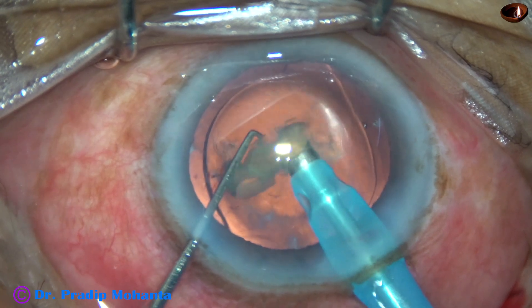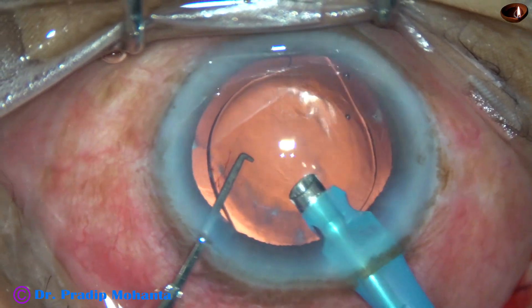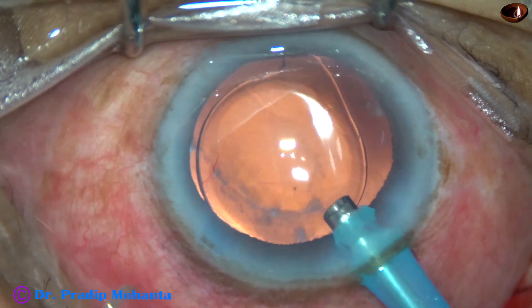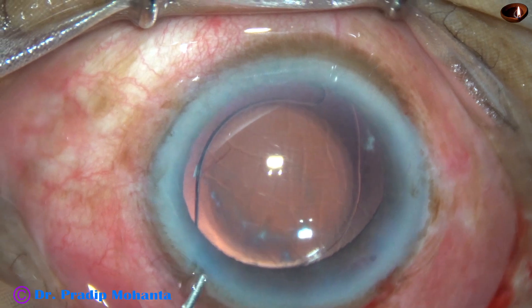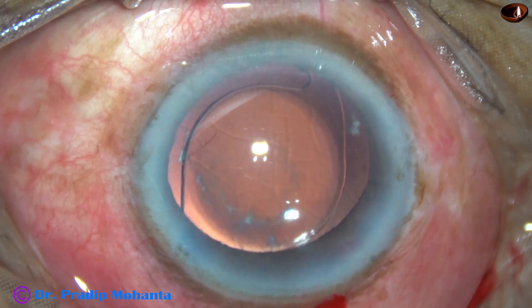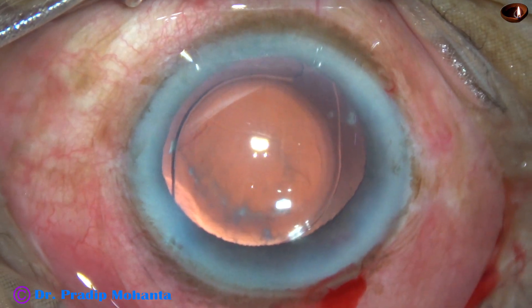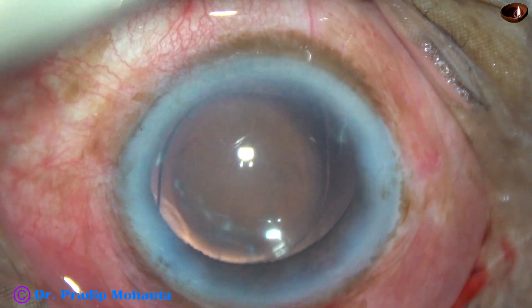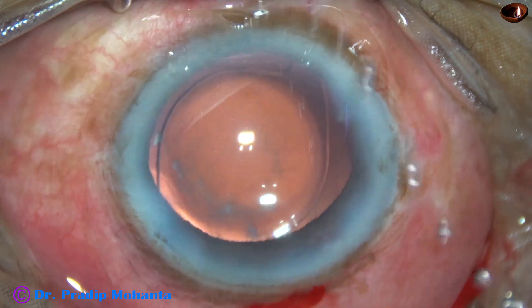I recommend this technique for all my colleagues in cases of hypermature morgagnian cataracts. If we don't do this, in many cases we will not cause a rent — but in some cases, there is a chance that you will catch the posterior capsule and cause a rent. But if you use the IOL as a scaffold, there is no chance of catching the posterior capsule. So this is a foolproof, 100% foolproof way of emulsifying the last piece.